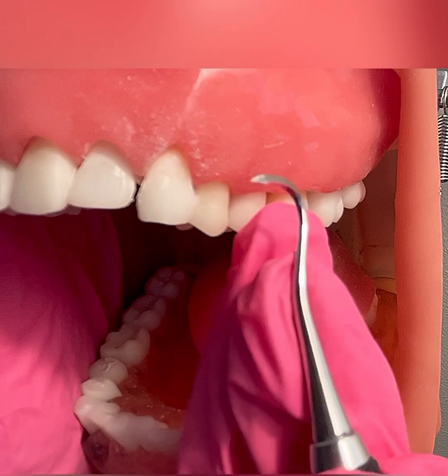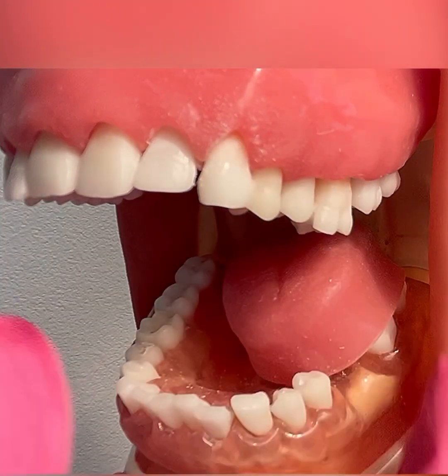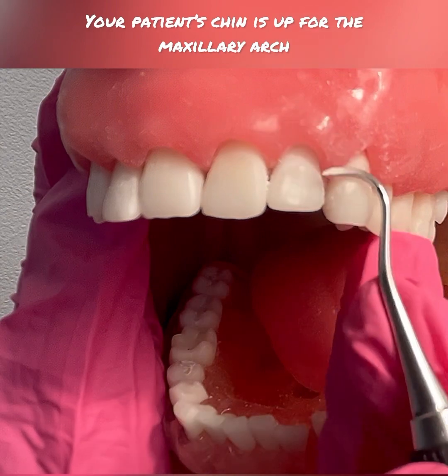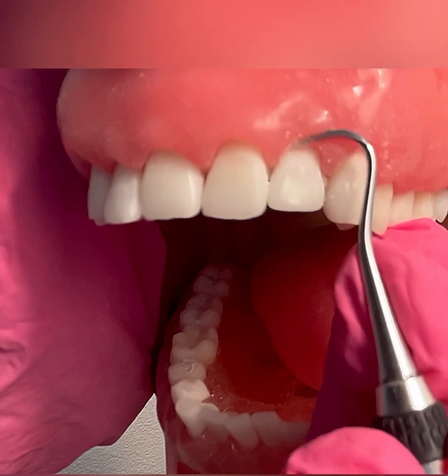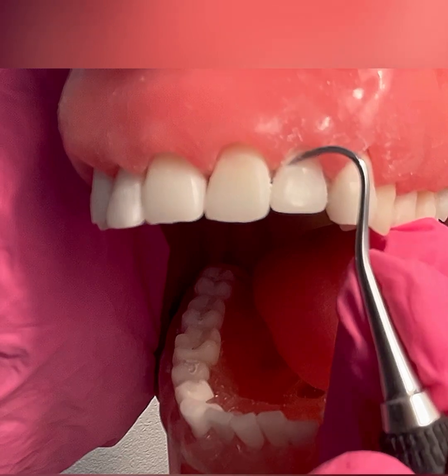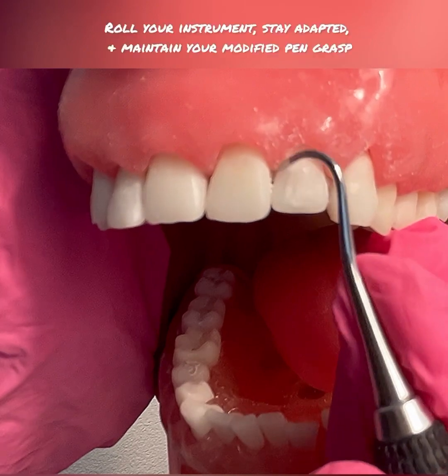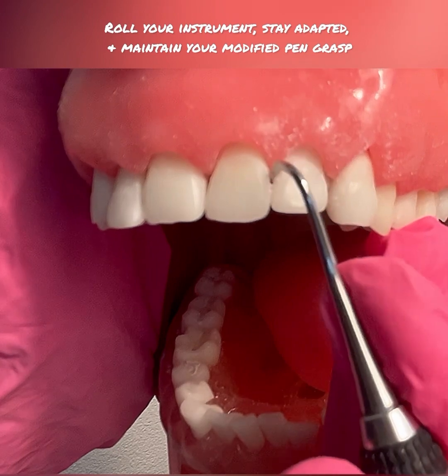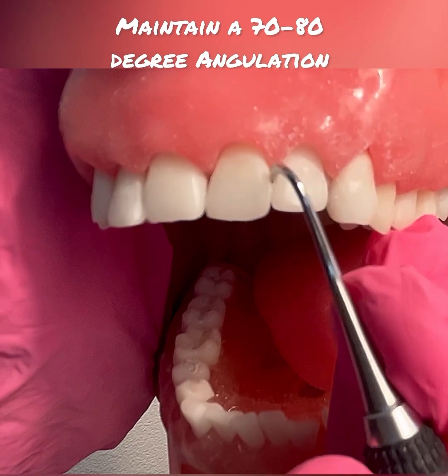After I scale tooth number 11 surfaces towards, I will now go to tooth number 10. My patient's chin is up because I am working on the maxillary arch. There's an imaginary line bisecting right around the midline. I'm adapting the tip third of the instrument, using short, controlled, overlapping vertical strokes, maintaining good ergonomics and modified pen grasp. I'm going to roll my instrument between my index and thumb, coming into the mesial interproximal, maintaining a 70 to 80 degree angulation.